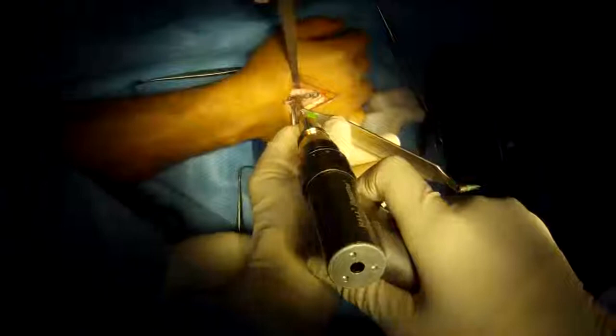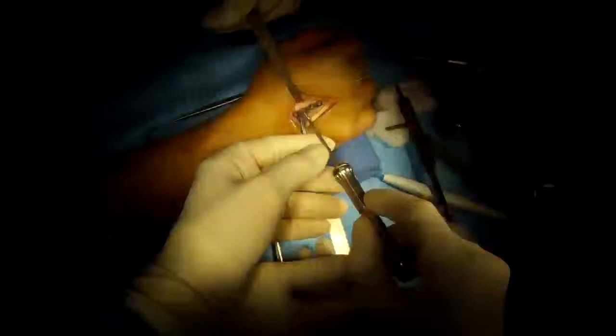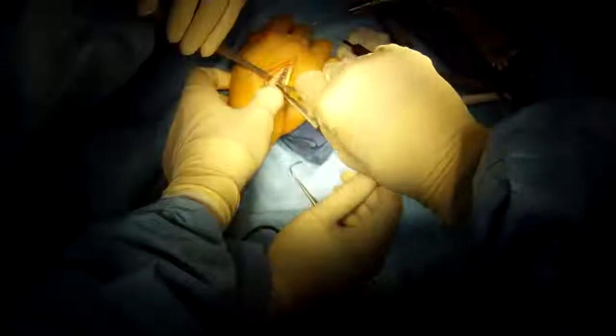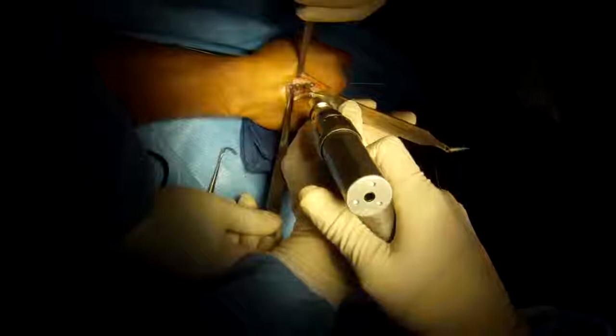I use a locking plate. These screws actually thread into the plate — it's a very strong construct. We want it strong so we can start early motion, decrease the stiffness and scar formation. I'm going to lock the screw into the plate, drill on the other side, and place that screw.